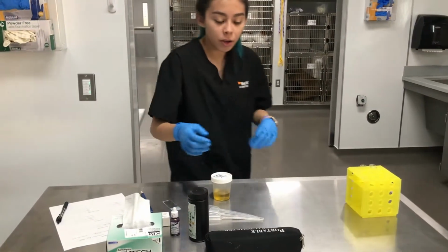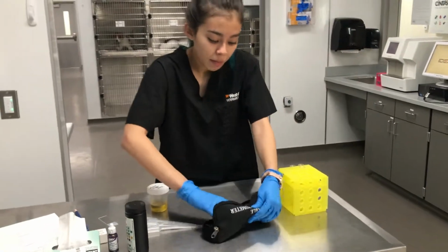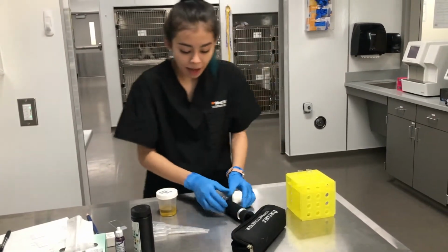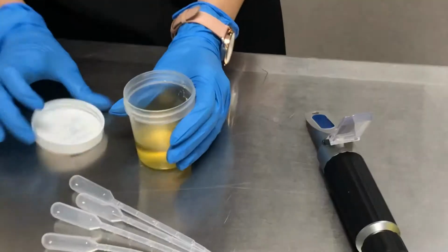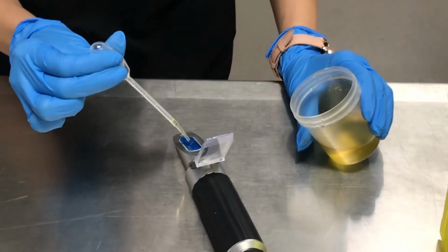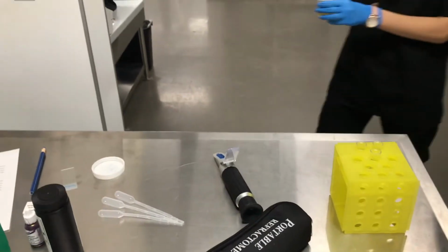So next, I will pull out this refractometer and determine specific gravity. So using a pipette, I'll collect a drop of urine and place it on the refractometer. And I will dispose of this pipette after I'm finished.